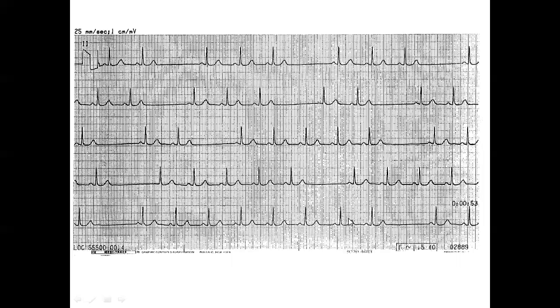Interesting, very regular rhythm. All of a sudden, pause. What is this pause made of? It's exactly 2 basic cycle length. Unfortunately, we don't have a caliper, but let's try this. It's exactly 2 basic cycle length.